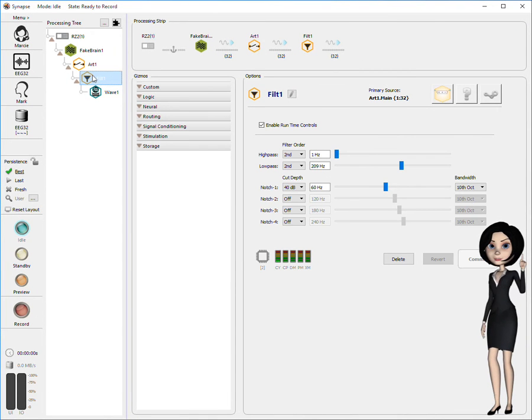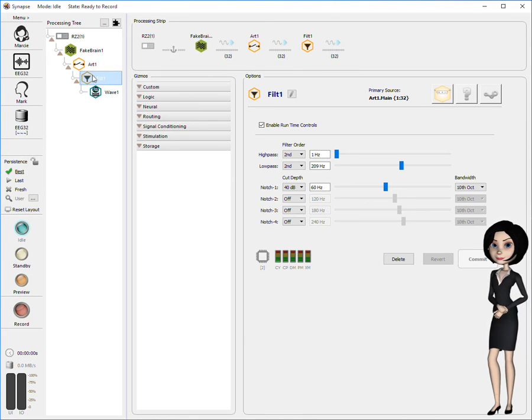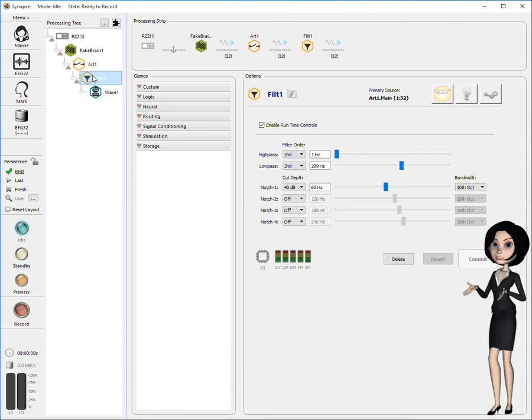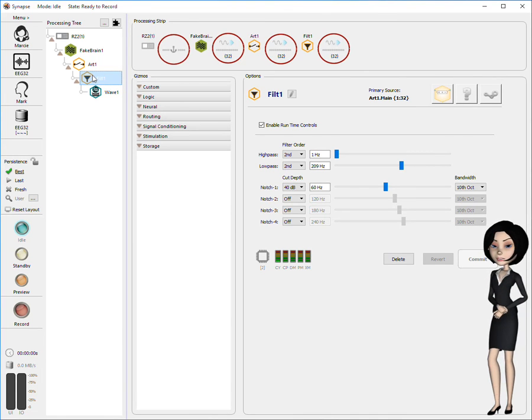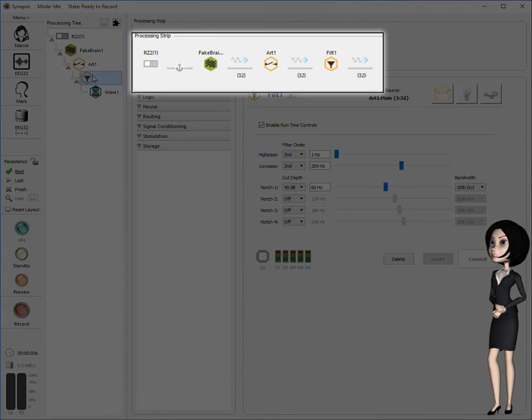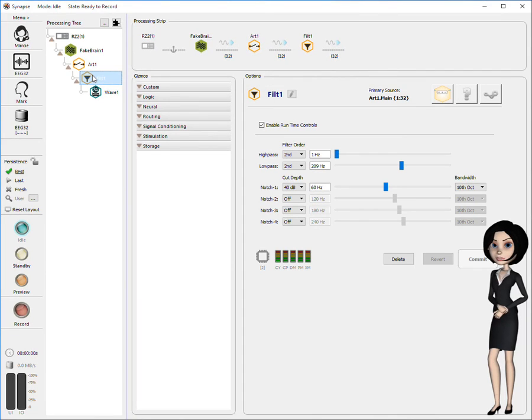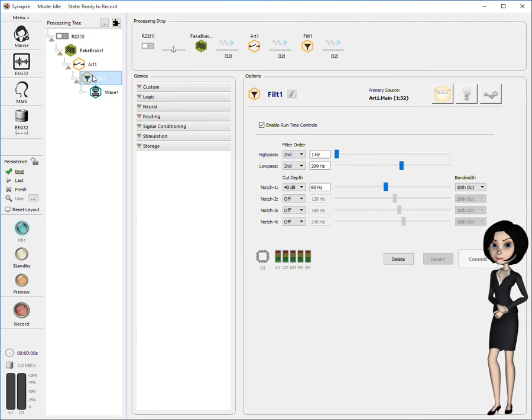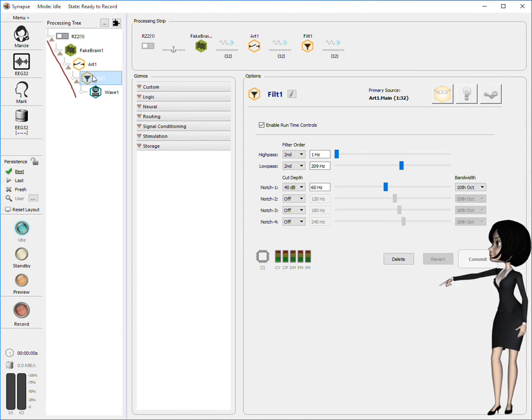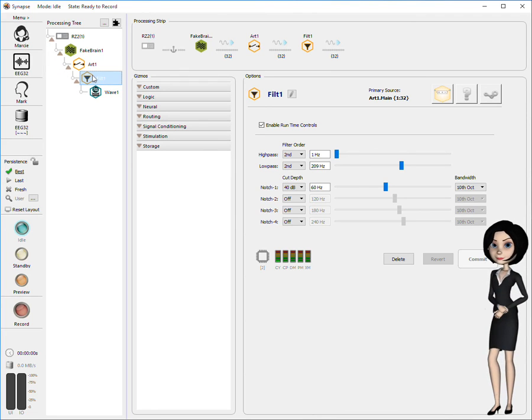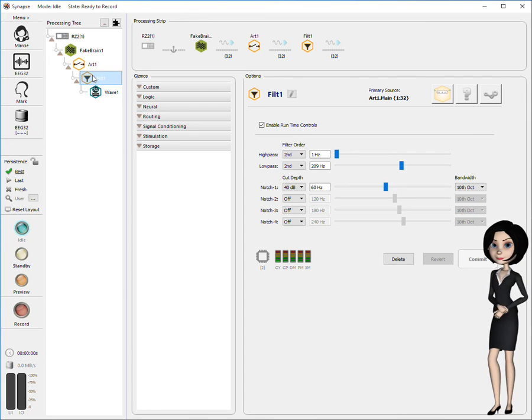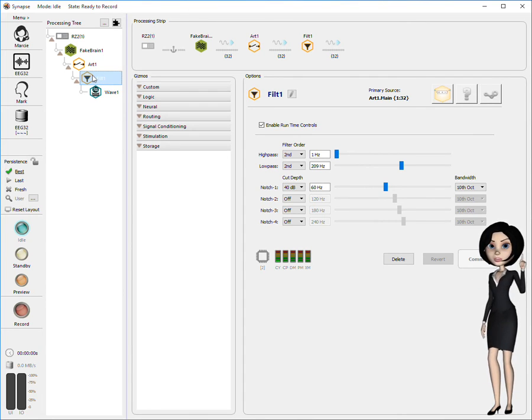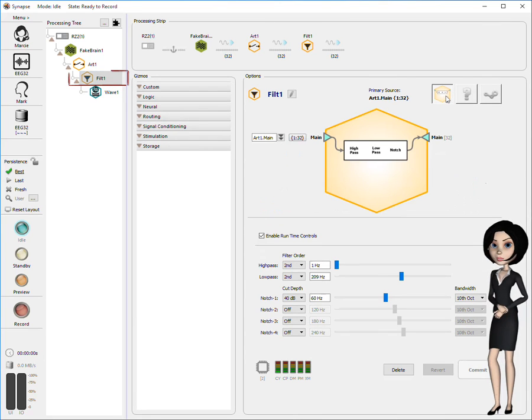This is probably a good time to explain a bit more about how gizmos are linked together in an experiment. As I've said previously, Synapse is a signal-driven system. This means that gizmos are connected together and ordered by the signals that flow between them. Looking at the tree or strip views, we can quickly review the primary or key links between the gizmos of our experiment. Be aware, every gizmo must have at least one input so that it can be connected to a parent element within the processing tree. While not depicted in the tree or strip, many gizmos have secondary inputs and outputs as well. The secondary inputs are reviewed and connected via the connections panel in a gizmo's dialog. This panel is revealed by pressing the connections button when an item is selected in the tree.